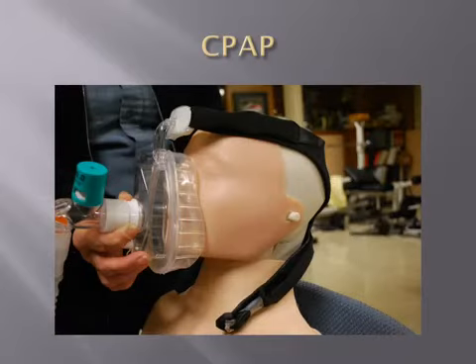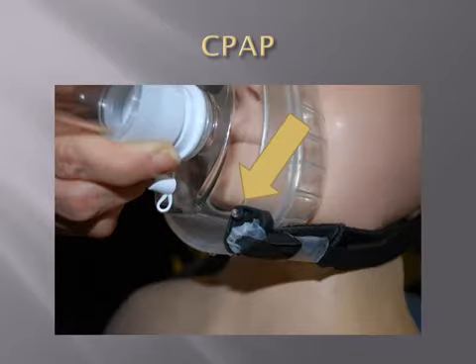Now, go ahead and place the straps behind the patient's head and have them come down by the neck. You will see that there is a connector at the bottom of the mask on both sides. Go ahead and apply the straps to the mask.